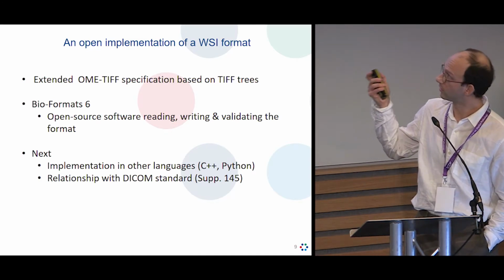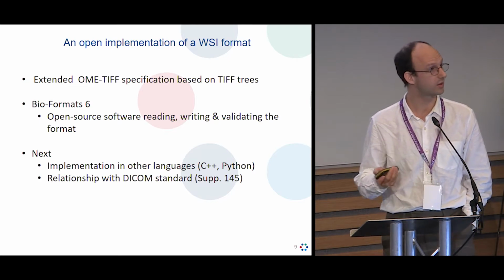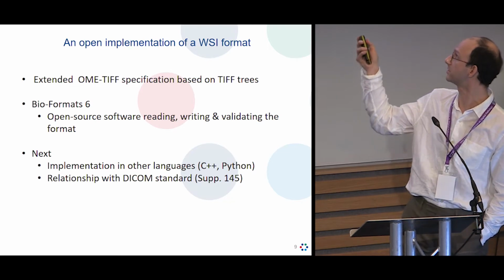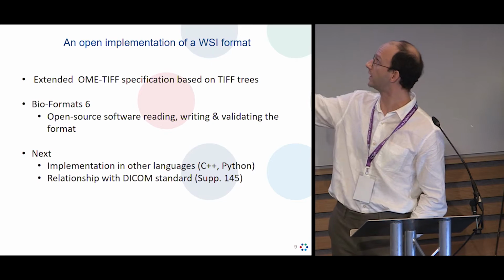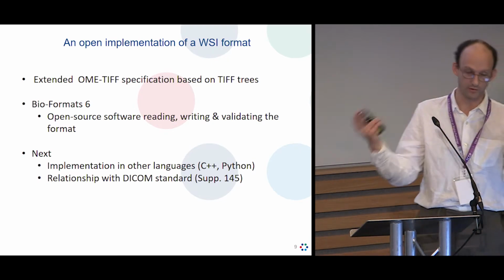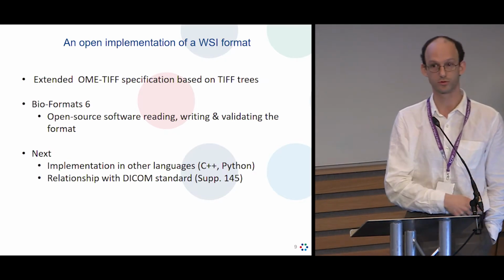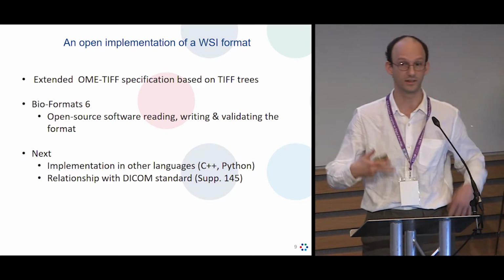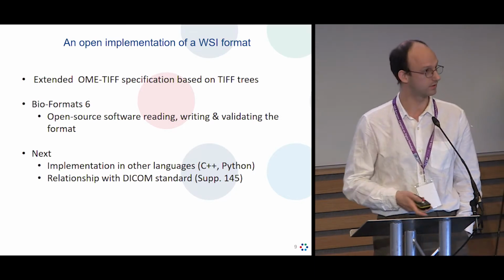What we haven't done so far is looking at the implementation of this library in other languages, so other ecosystems that we need to look at, especially for all the manufacturers and the analysis community, but also the relationship with the DICOM standard, which proposed the supplement 145 to do the same thing in the DICOM ecosystem. So we went yesterday and joined the working group 26, and I'm really looking forward to more discussion in the next few days about the state of the art and the upcoming of such alternative versions.